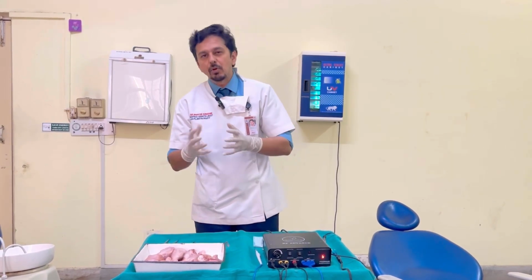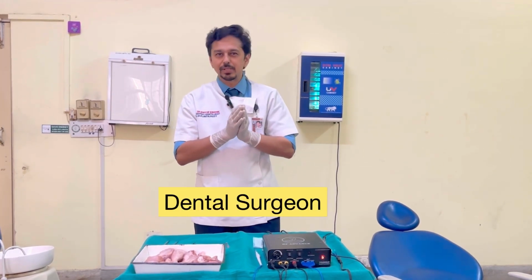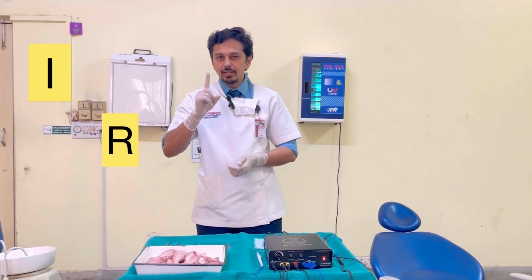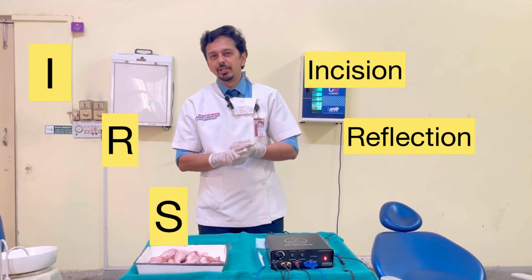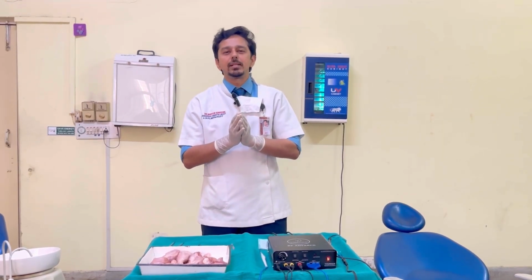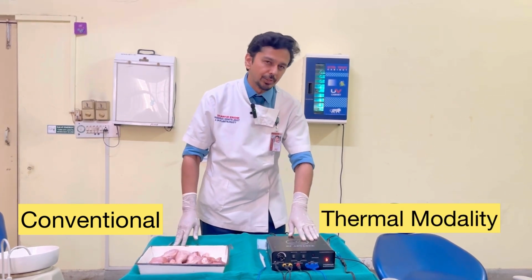So always and always I emphasize that we have to remain a dental surgeon throughout our life, not just a plain dentist. Other than painless anesthesia, IRS, incision, reflection and suturing has to be strong. So when it comes to incision, basically, we have conventional versus a thermal modality like electrosurgery.